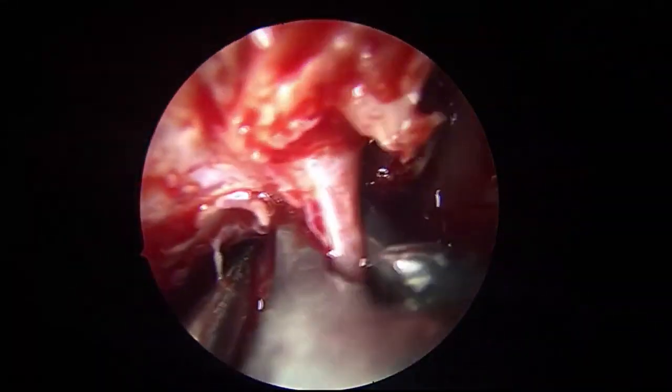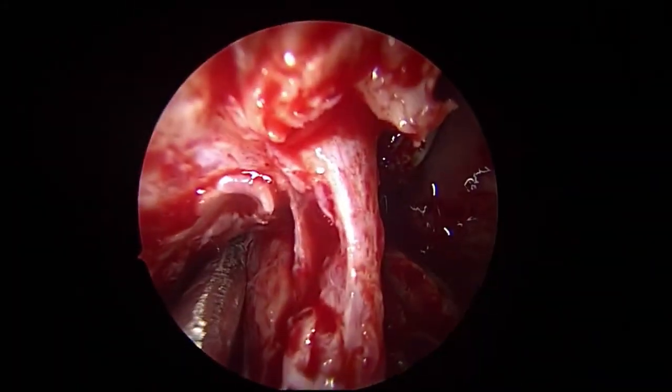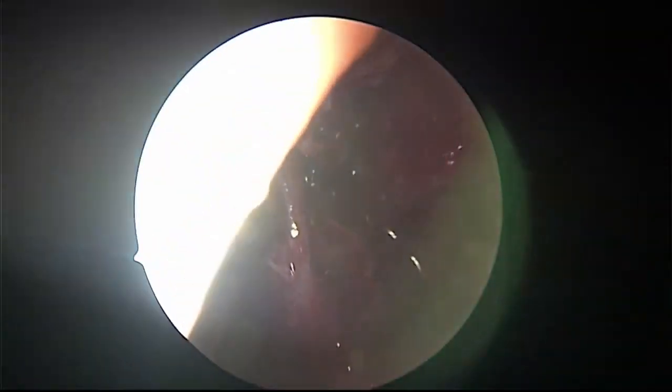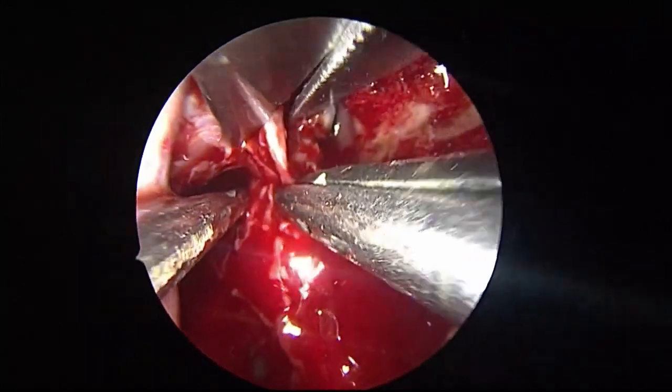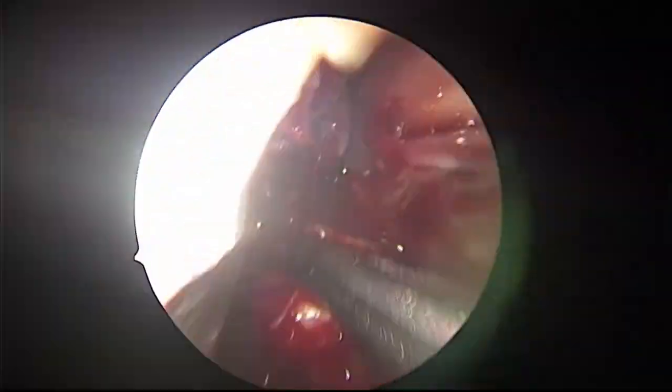Can you see the orbital floor laterally? Orbital floor seen clearly. See clearly. At this level, this is the level of the orbital floor. I will cut it flush. That's it.